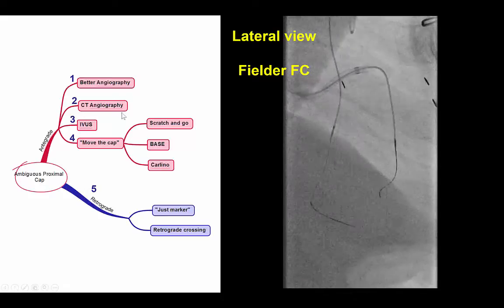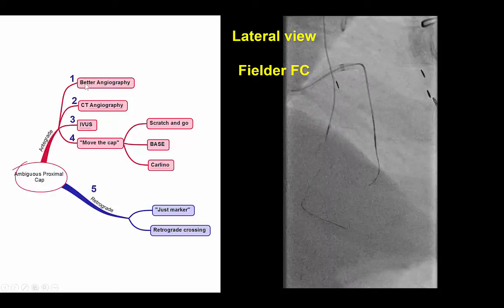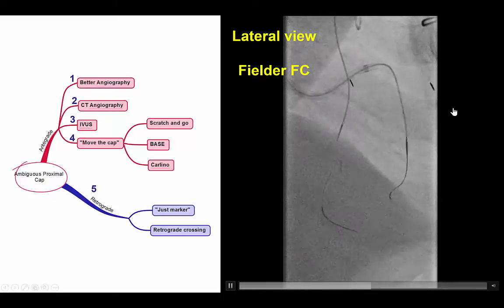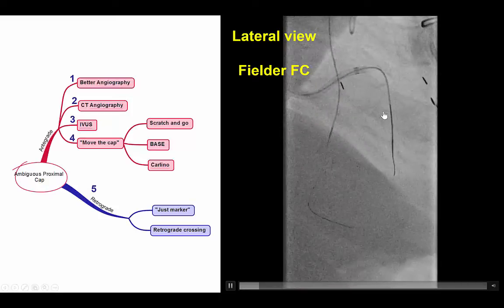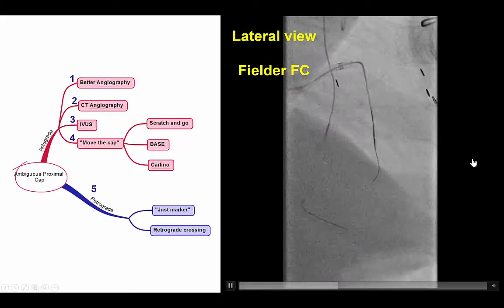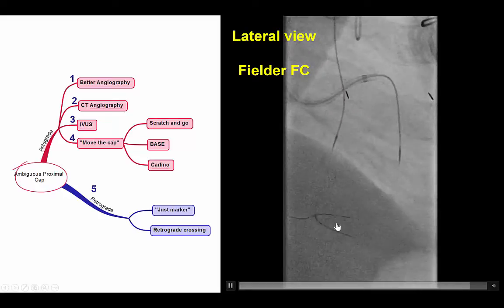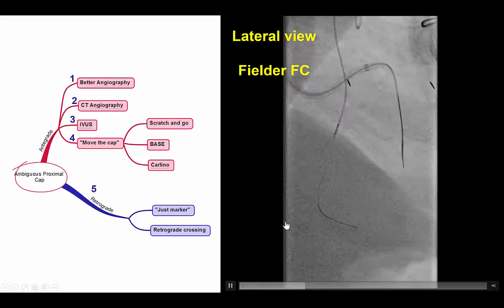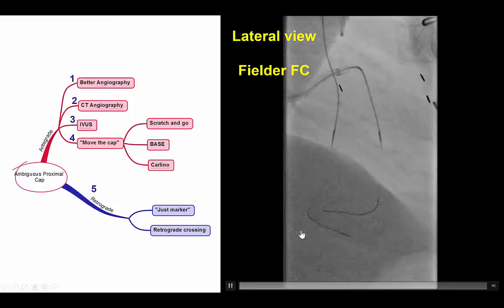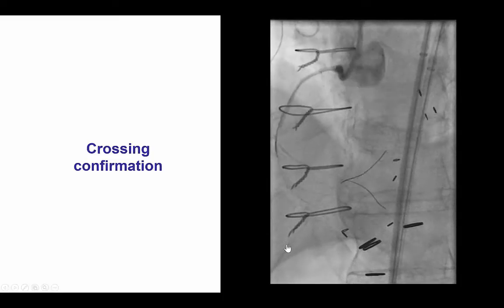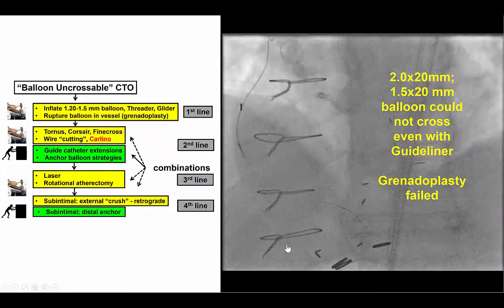We did not have CT angiography. Intravascular ultrasound could have been an option, but before that, we performed angiography in the lateral projection, which is quite often very helpful for lesions in the mid-right coronary artery — it provides a nice separation between marginal branches that go anteriorly and the continuation of the right coronary artery which curves down and to the left. By doing that, we were able, surprisingly, with a soft Fielder FC guide wire to successfully cross into the distal true lumen, as confirmed by contralateral injection. This was an extremely fortuitous turn of events.